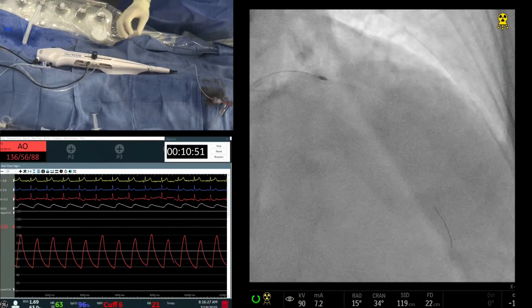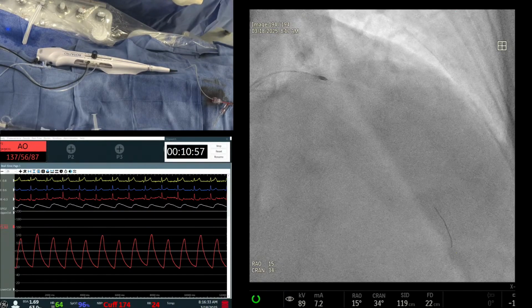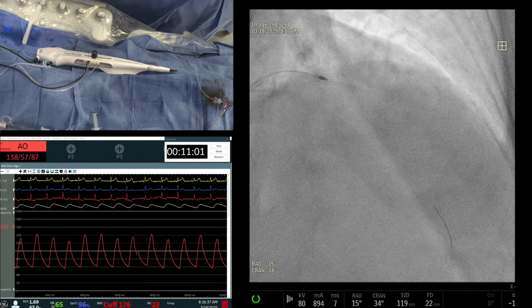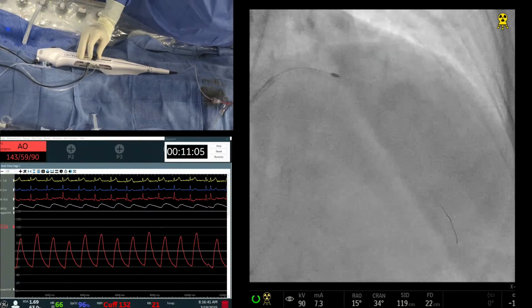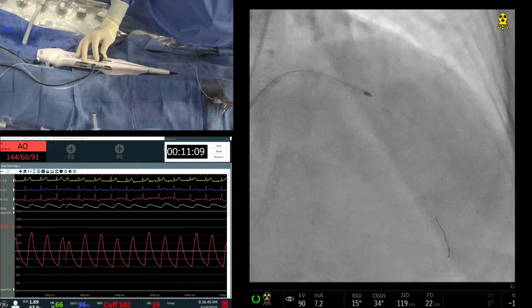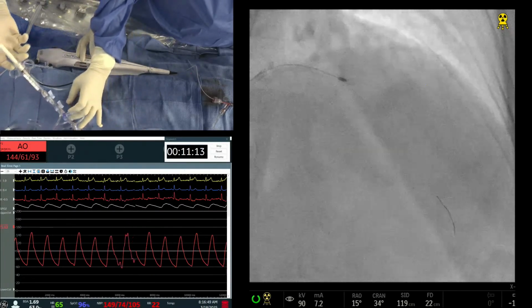And that's what we are teaching everybody, particularly with the radial approach. When you don't want to go with the venous access, if you are going to the groin, just put a pacemaker. If you are not using the femoral artery, then you want to avoid the femoral vein. So giving aminophylline and atropine is a good combination. I think it was a good idea to use the 1.5 there.